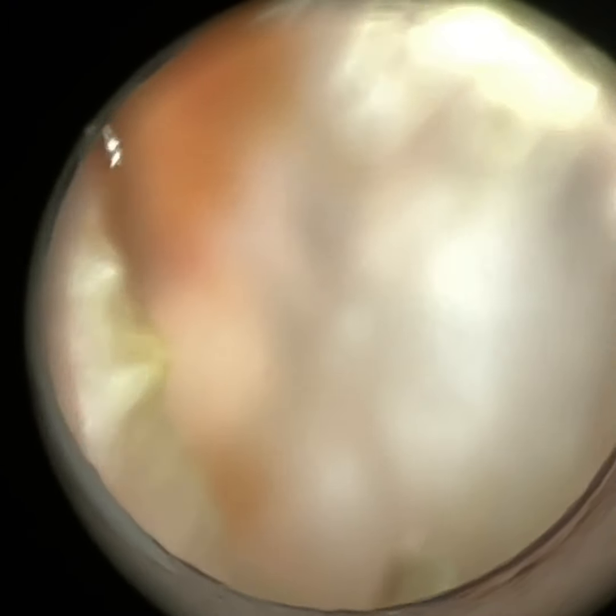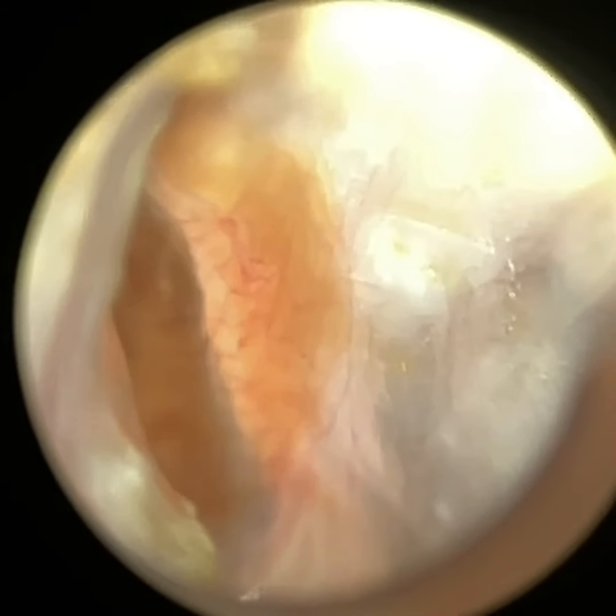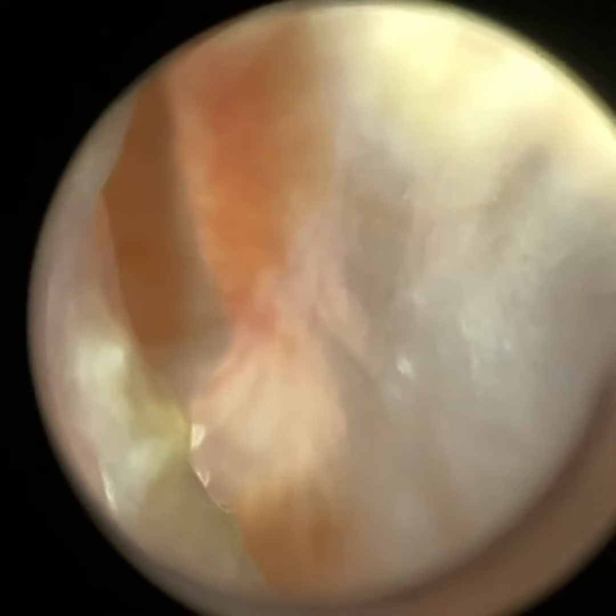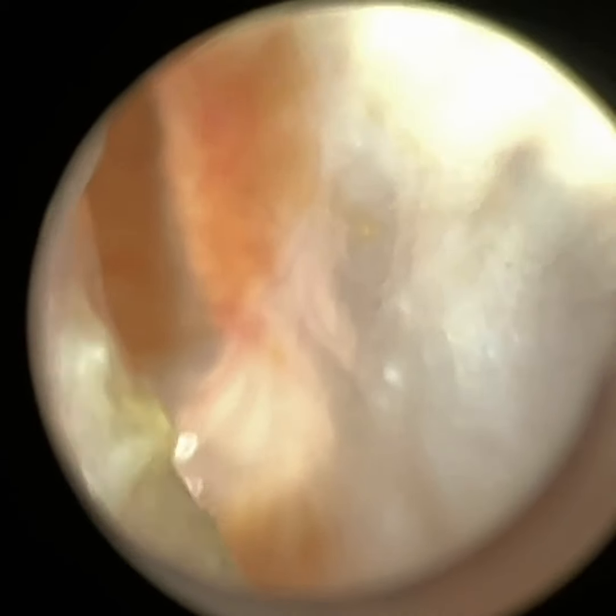There's a bit of macerated skin at the bottom. The patient is going to use some acetic acid sprays to re-acidify the ear. Now there's a bit of wax in the anteriors.